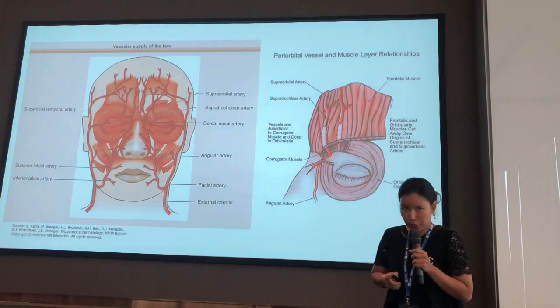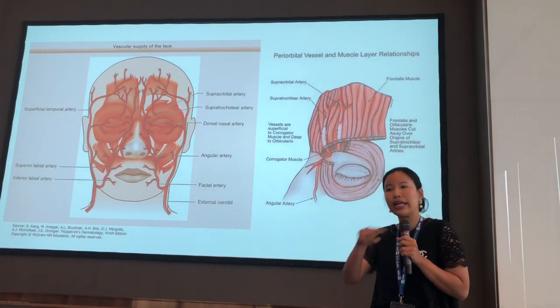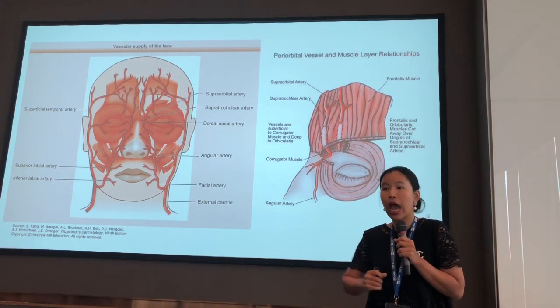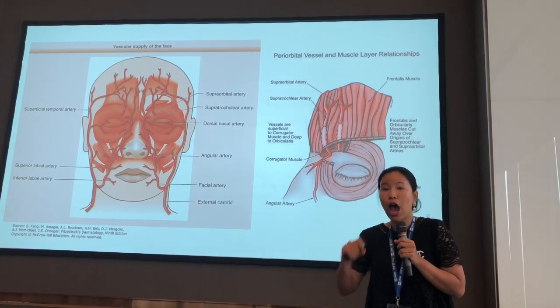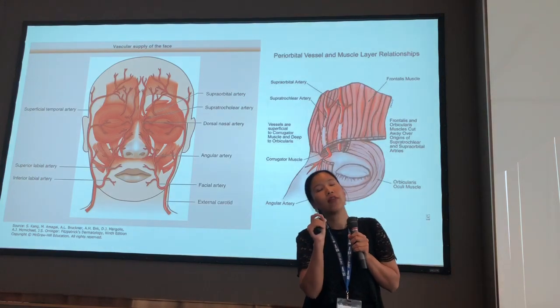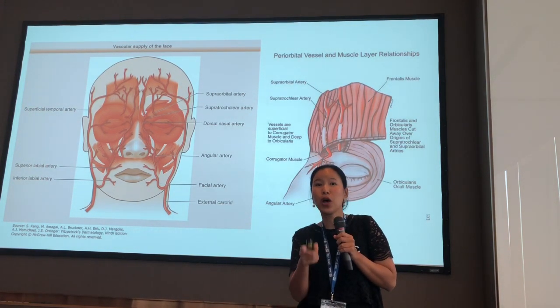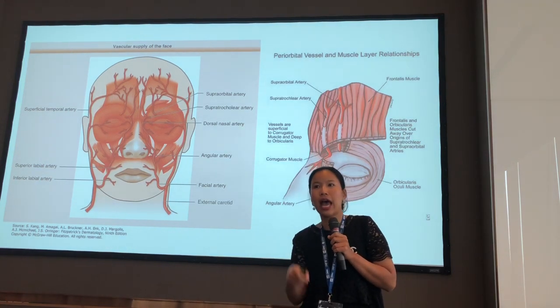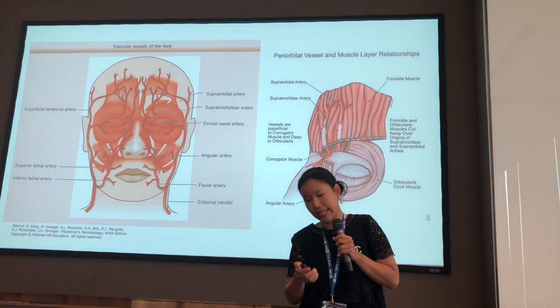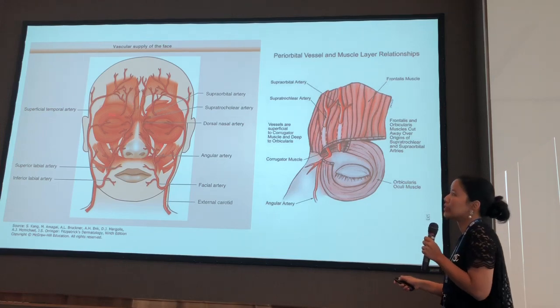You have to remember, when you do any procedure or injection, you have to keep in mind the X, Y, Z axis of injection. The depth is so important. Normally, you have been trained in the anatomical landmarks for injection on X and Y, but you do not know the Z axis. What is the depth in there? It can cause complications easily that way.